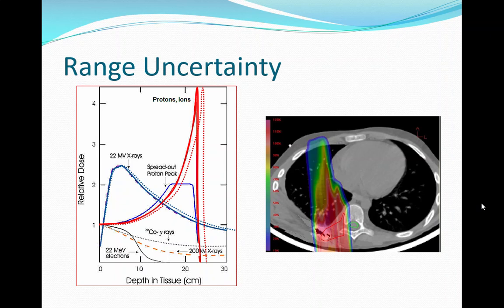Near the spinal column means I would like the protons, I don't want the spread. But I also don't want that to carry through to the front and cause radiation beyond. Now, that'll happen with x-rays too, but we're trying to avoid that. And in our case, the dose spread is pretty high, you can see, for some of these. So I really don't want to damage your lungs and make it more difficult for you to breathe.